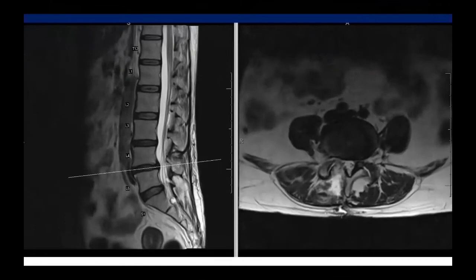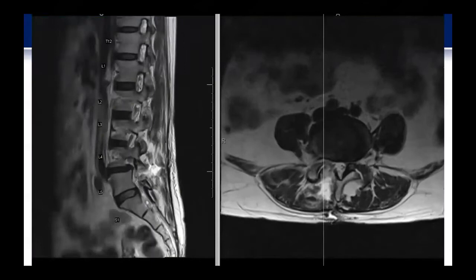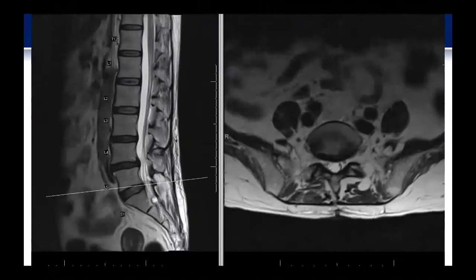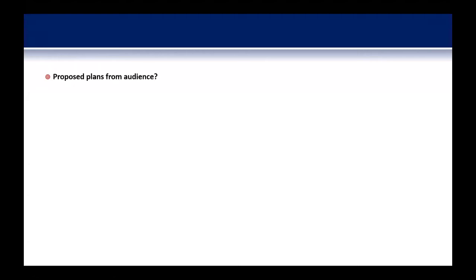This is her MRI examination. You can see L3-4 is pretty much wide open. At L4-5, you can see the previous laminotomy site on the parasagittal images. There is maybe some mild continued neuroforaminal compression; however, it's likely dynamic in nature as evidenced by the previous X-rays. L5-S1 is pretty much wide open. I'm going to open this up to the audience to make any suggestions about what treatment should be offered to this patient going forward.